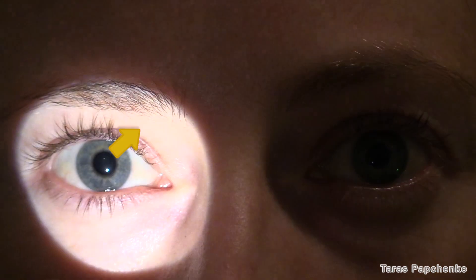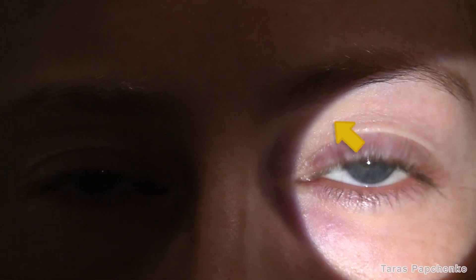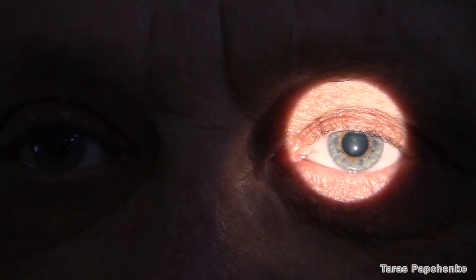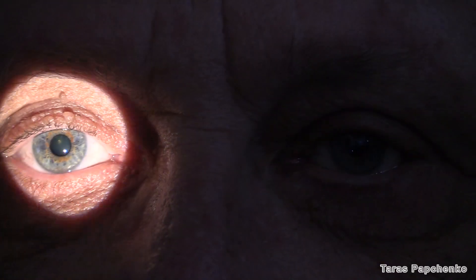Today I'd like to demonstrate a technique for assessing a patient for relative afferent pupillary defect. In simple terms, testing for an RAPD demonstrates if there is a difference in the amount of light that each optic nerve conducts to the midbrain. In other words, it assesses the health of one optic nerve relative to another, and it does so by comparing how both pupils react to the swinging flashlight test.